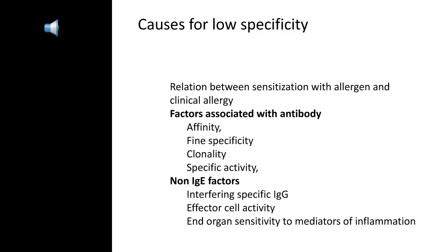But also, I have to emphasize, there's a lot of non-IgE mediated factors that interfere. There's interfering IgG, there's problems with the mast cell and how it reacts to the specific IgE, and also there's how the histamine impacts on the vessels and the immune mediators, etc. So the association between sensitization and clinical allergy is very complex, and therefore just altering a test to make it better doesn't necessarily improve specificity, and I think we have to emphasize that.